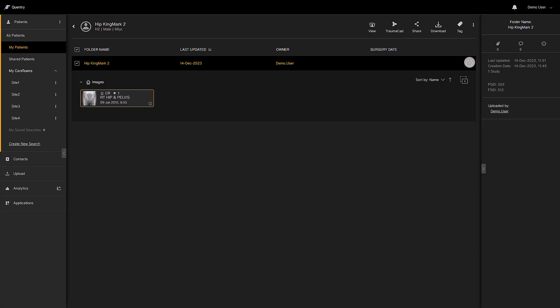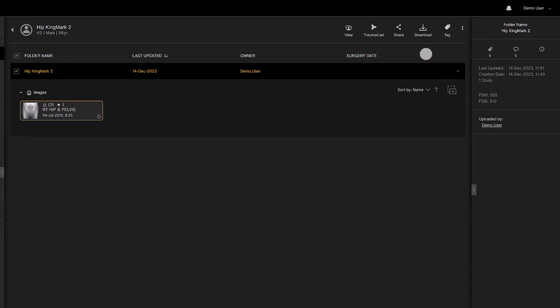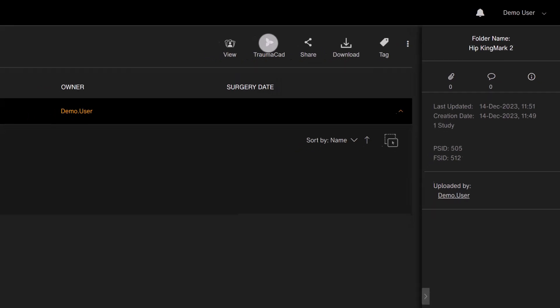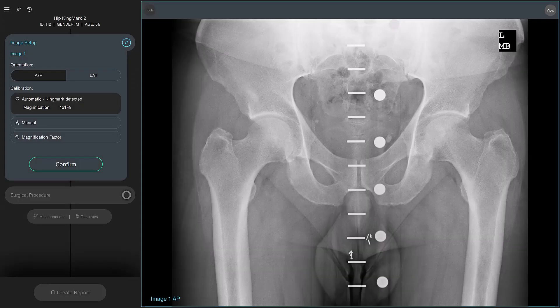Launch the TraumaCAD NEO software by selecting the button in the toolbar. The previously selected image is automatically loaded into the software.